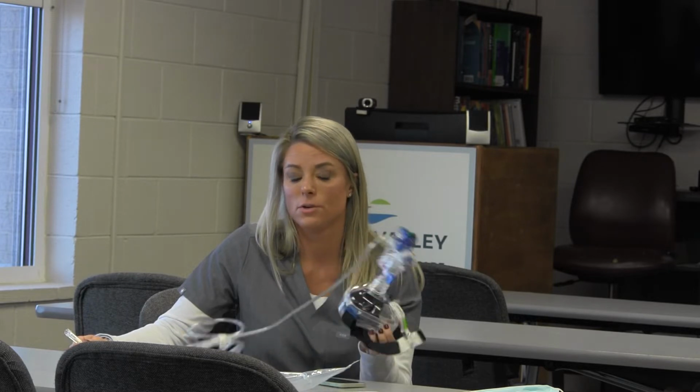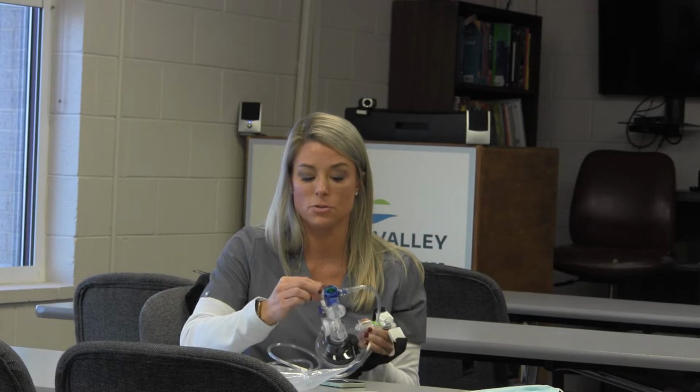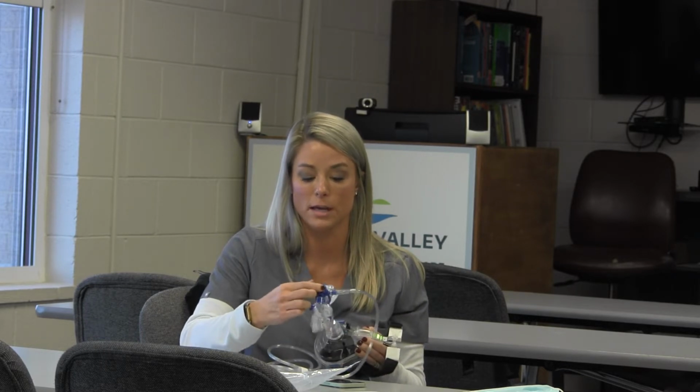Are you guys familiar with bi-level for transport? We're working on it. Okay. Bi-level just means they're providing an inspiratory and an expiratory pressure, so helping them do more of the work. For your patient base that needs this, like your hypercapnic patients, it's nice because you're getting a device that can do 2 things. Depending on your patient needs, if they're over breathing it in the bi-level, you can switch it back to the CPAP mode, which is right here at the end.